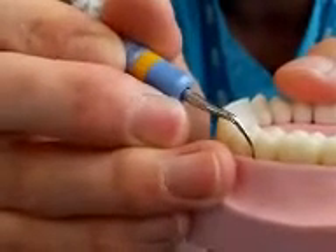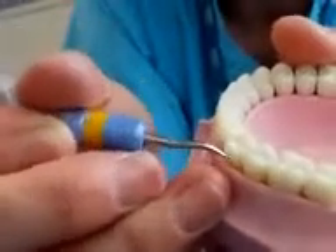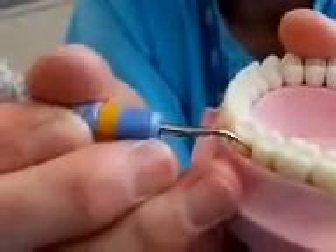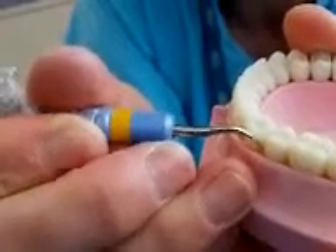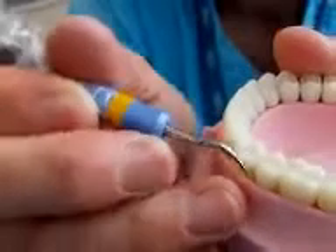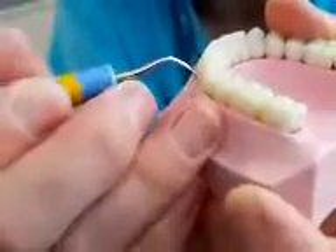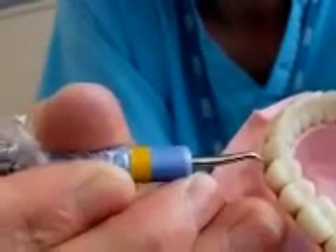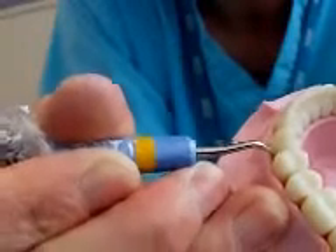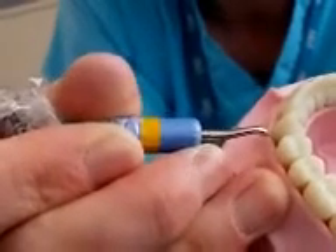You're not causing pain to the patient. It's easier to go around and clean without local anaesthetic. Tell your patient to tell you when it's uncomfortable on the gum. The motion would be something like: coming around this tooth here with gentle, small movements — you're just gently easing it down until you feel the pocket.